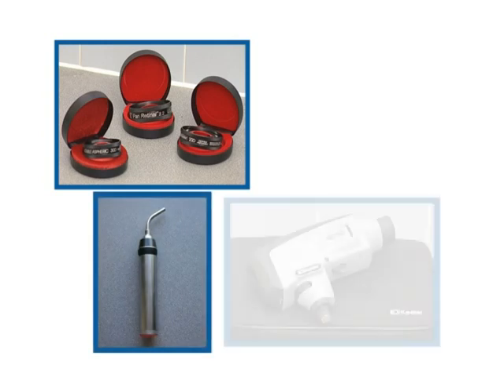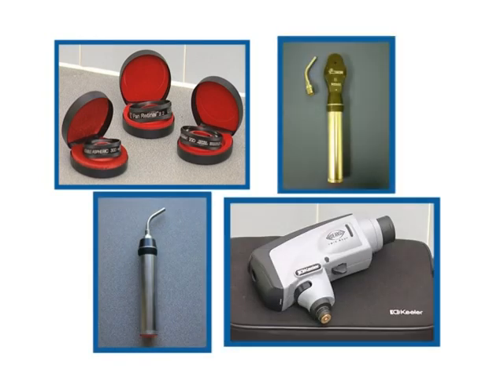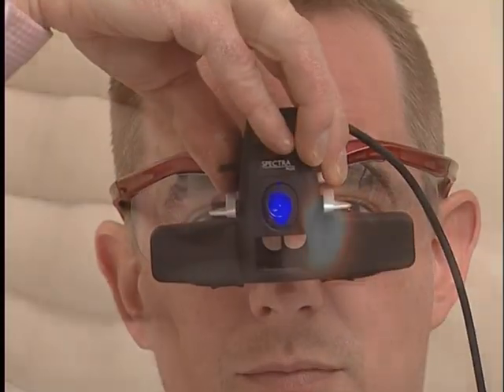All 3 ophthalmoscopes have their specific advantages, and only personal experience will truly determine which technique suits the practitioner best. However, there is no one technique that will cover all situations, and it's therefore best to gain experience in all equipment.